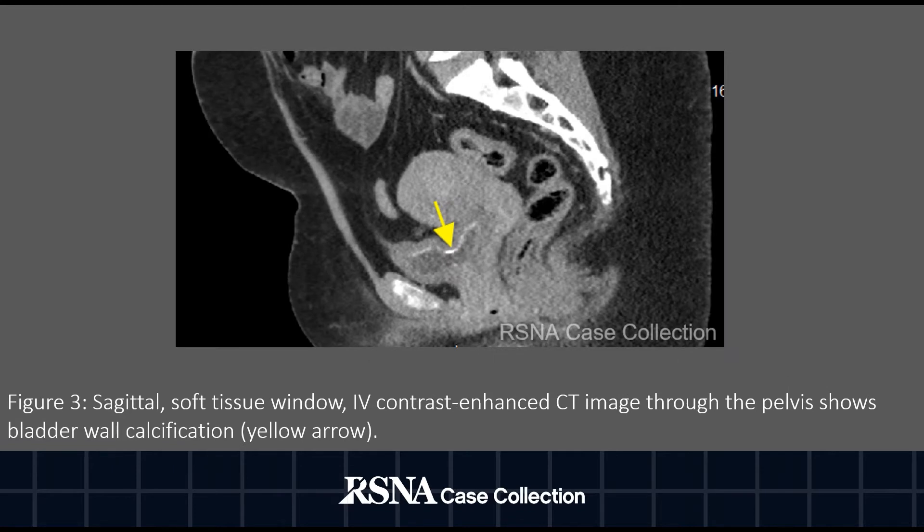Figure 3. Sagittal soft tissue window IV contrast enhanced CT image through the pelvis showed bladder wall calcification.